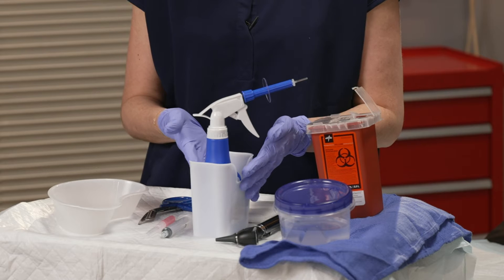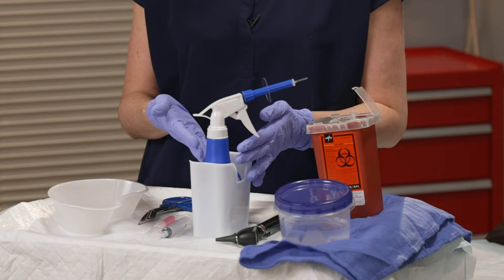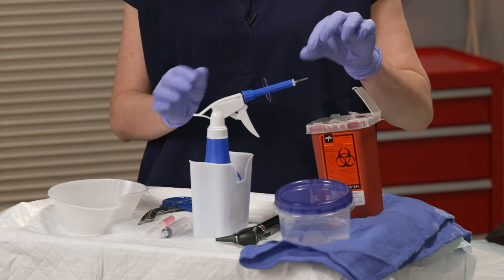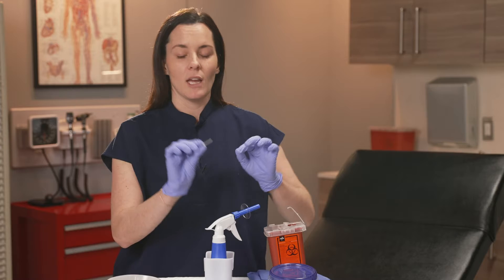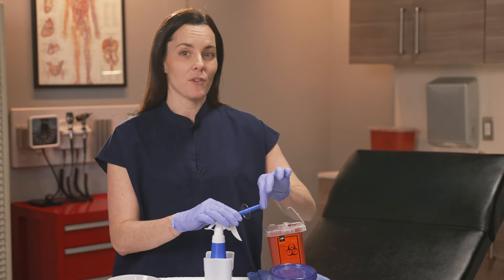Many facilities have these pre-packaged irrigation devices, just like this one, where you can spray directly into the patient's ear to irrigate. As a pro tip, they come with disposable tips, so just make sure that you attach this to the device so that it's ready for the provider.